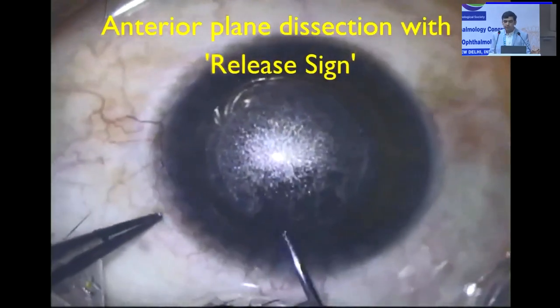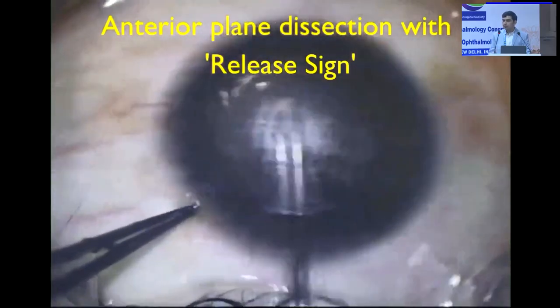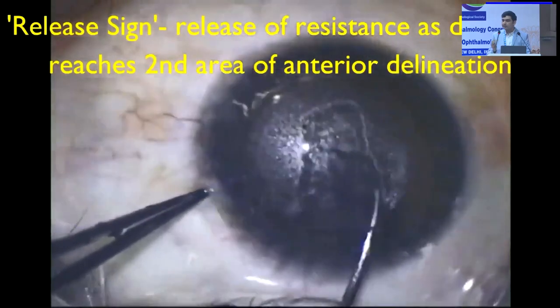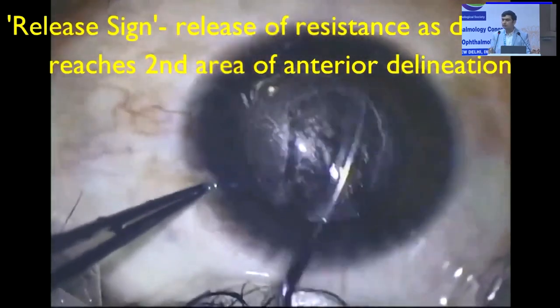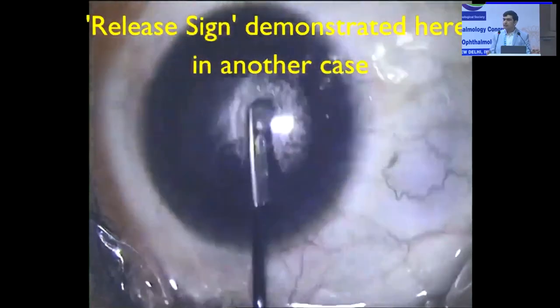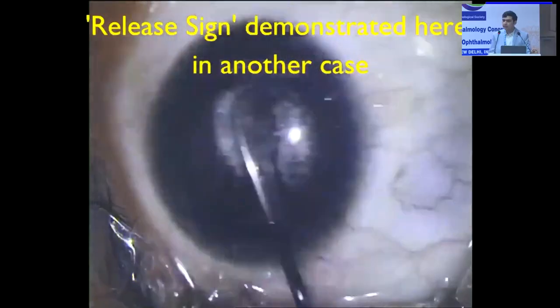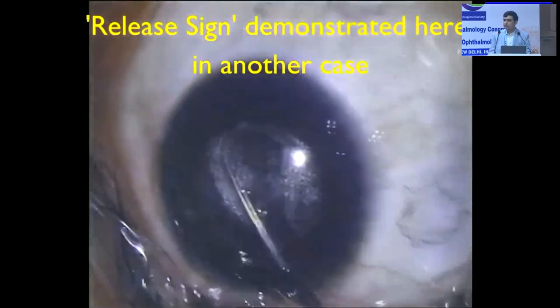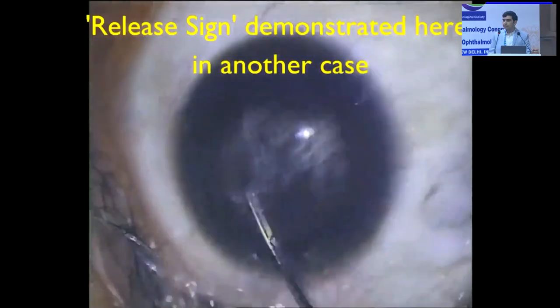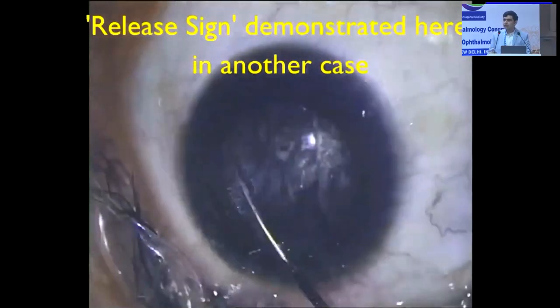And when we do the anterior plane dissection, you can start from any of the sides. As you move across to the undissected part and you reach the second already delineated part, there is a sudden release of resistance of the dissector that you can note. This gives you another confirmation that you are in the correct anterior plane only, and you will see here again that there is a sudden release of resistance because that part was already delineated by you initially.